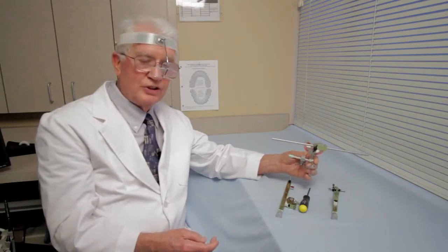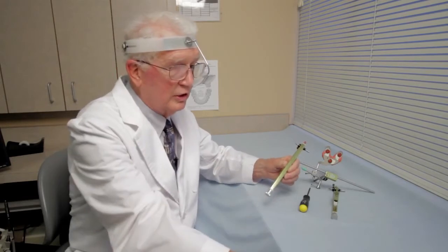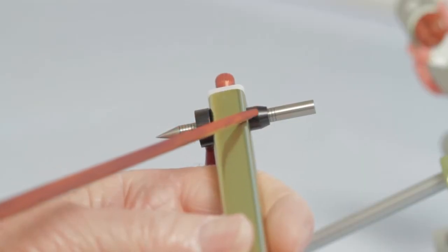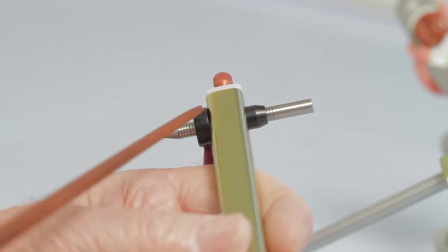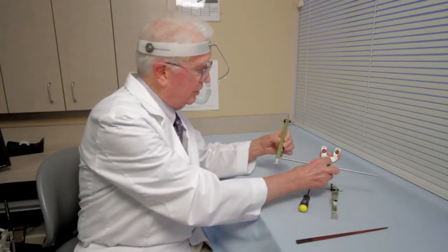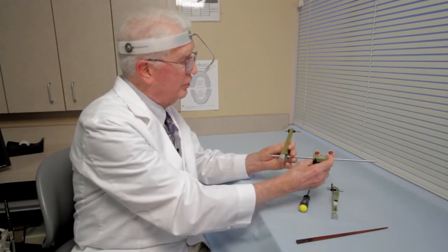Now, once we've accomplished that, we'll set up our side arms. I usually just use the side arms as we did when we actually placed them on the patient to do the recording. I place the bullet in with the stylus pen, and I put the dull side of the stylus pen toward the patient initially, and I put it at the 2 millimeter mark. It would then be placed on the patient on the side arm like this, and it would move in, and the dull side then would touch the patient's face.